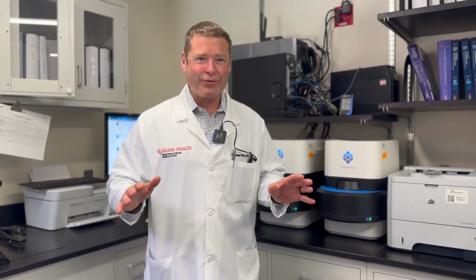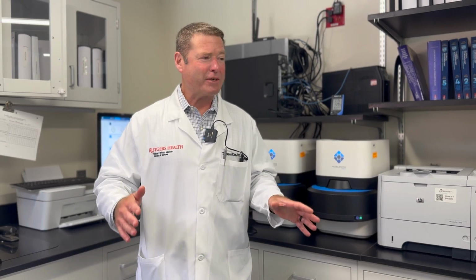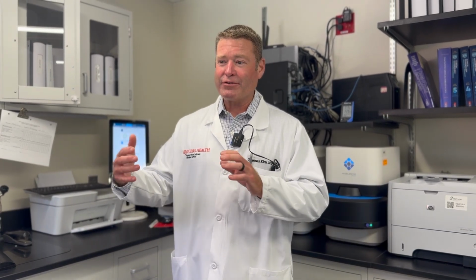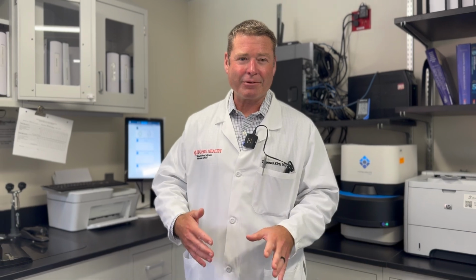So if all the stuff that I described to you isn't fast enough, we have faster ways of doing things for special kinds of cultures, specifically blood cultures. So we really worry about patients that have bacteria growing in their bloodstream. And so we have some rapid methods to identify and predict susceptibility for certain bacteria that grow in the bloodstream.